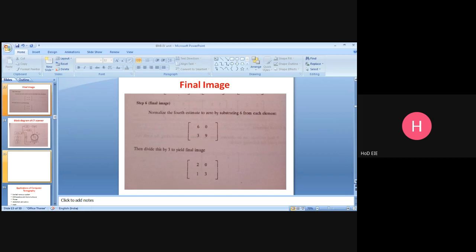Here what you are doing is taking the sum of the values along your northwest diagonal. So what are the values along your northwest diagonal? That is 2 comma 3. So there you are getting the value in your northwest diagonal. Okay, northwest diagonal.